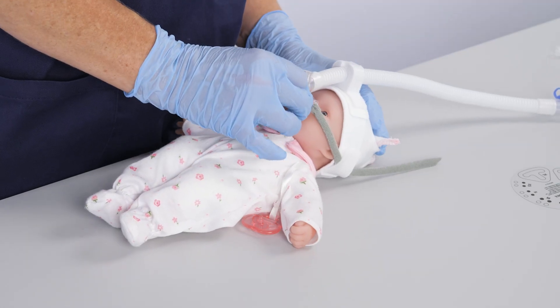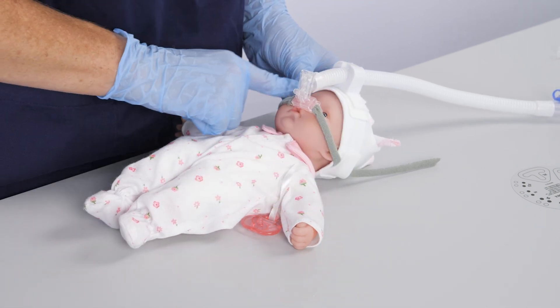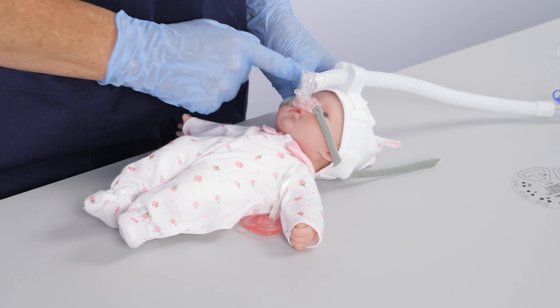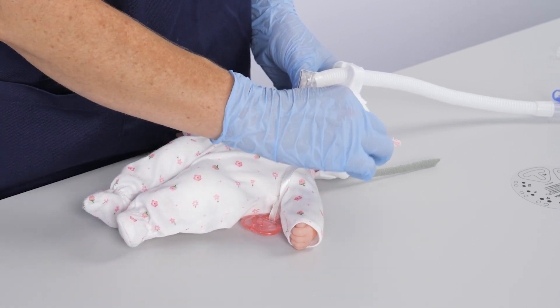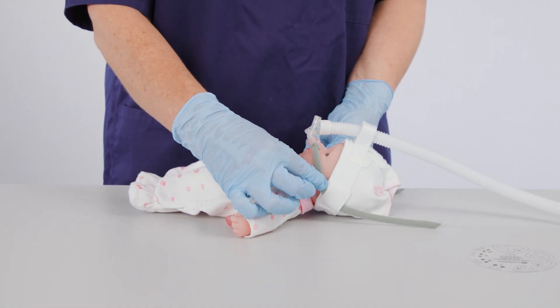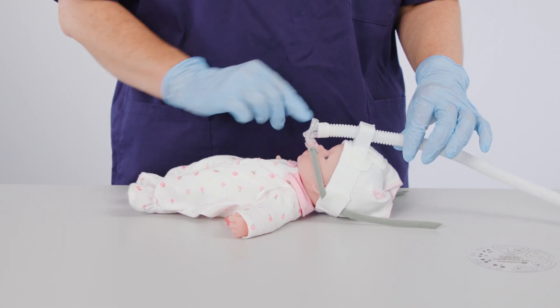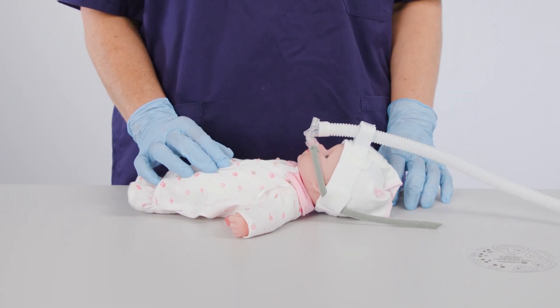Ensure the nasal prongs are still in place. Ensure the bonnet isn't too tight or too loose where it could fall into the infant's eye or press too much on the infant's head. Do not pull the grey ribbon too tight. The First Breath NCPAP generator is held primarily in place using the bonnet and fixation block.